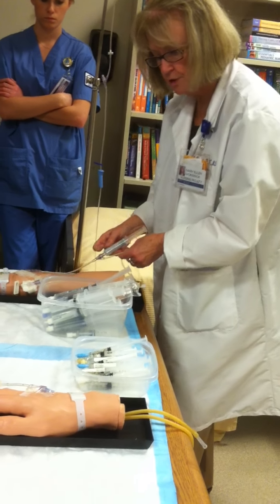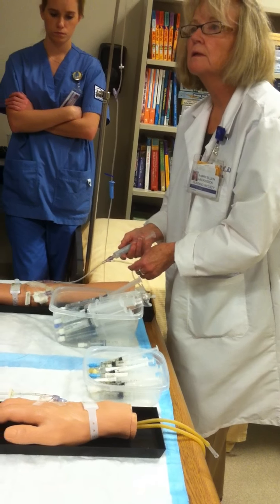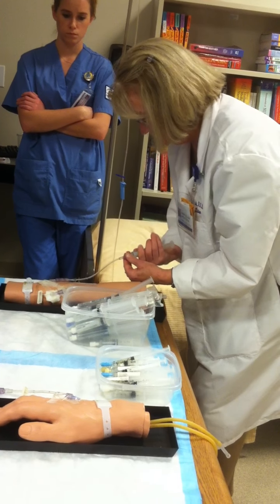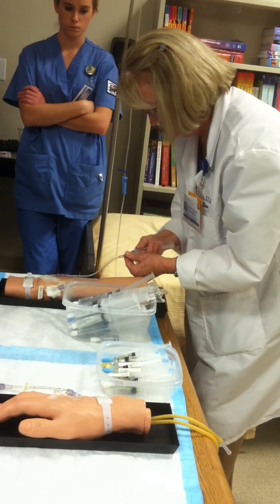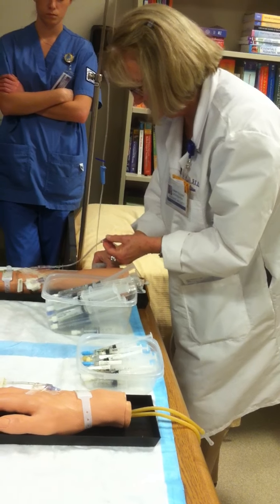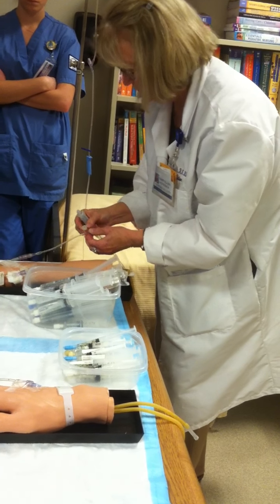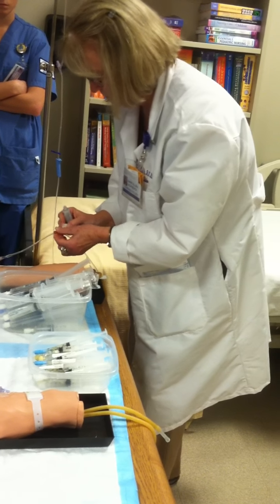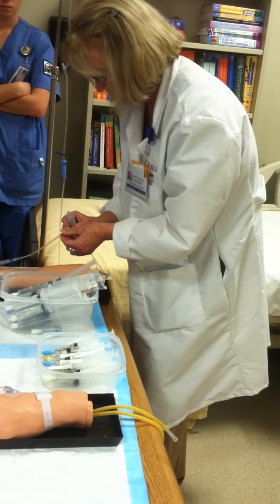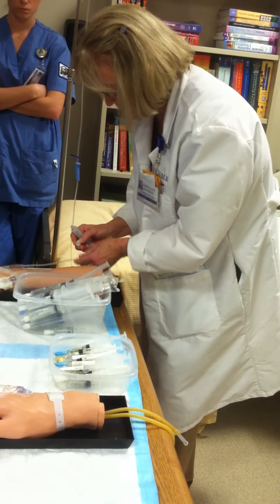We'll assume we push all of this in. Release the tubing and remove the syringe. Do not recap the used needle if used — engage the safety shield or needle guard if present. Release the tubing and allow the IV fluid to flow. Discard the needle and syringe in the appropriate receptacle.